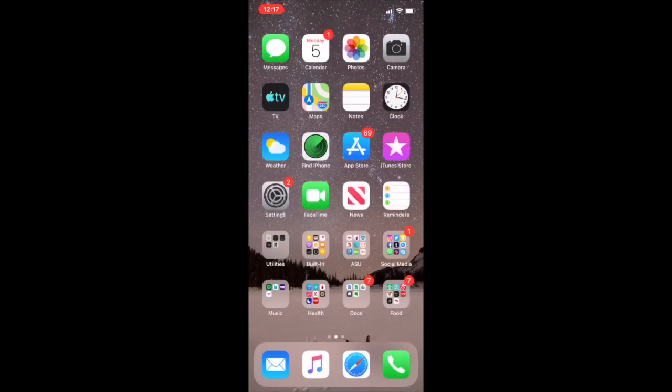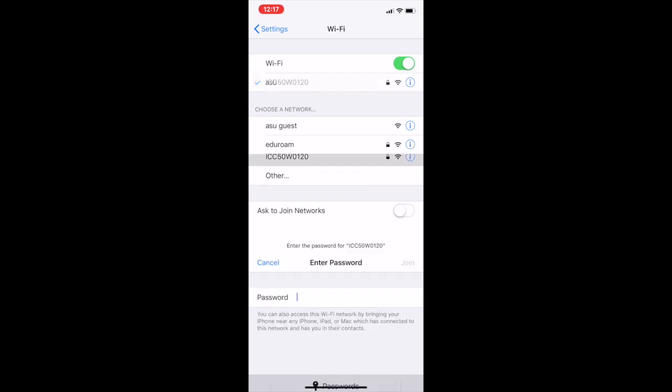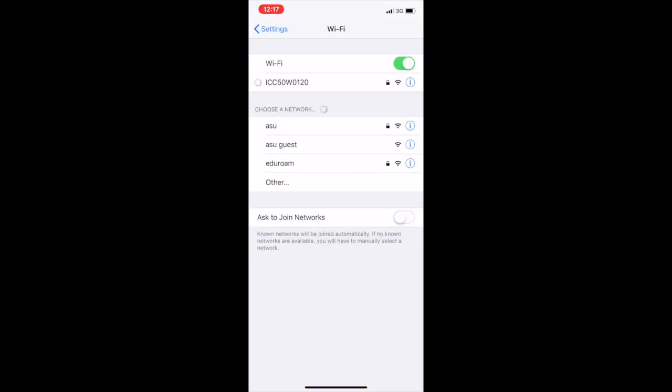Go to the Wi-Fi settings on your mobile device and connect to the camera scope Wi-Fi. The Wi-Fi name is the same as the serial number on the back of the camera scope, shown here. Enter the password located on the sticker on the top of the camera scope. The password should be all lowercase: Leica Micro.